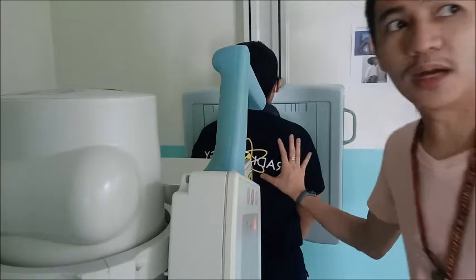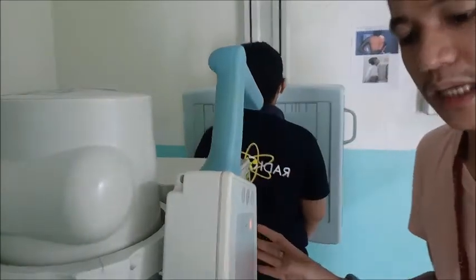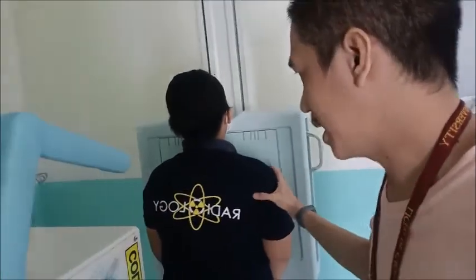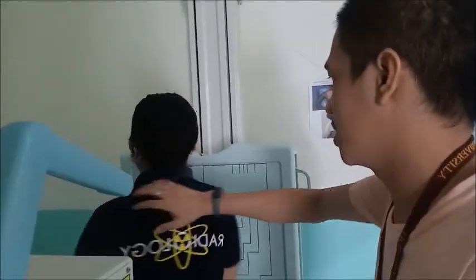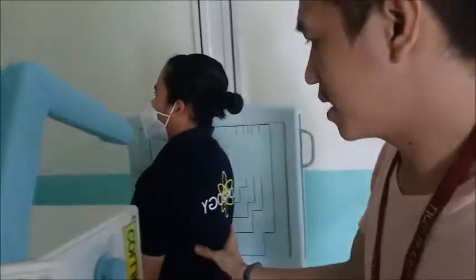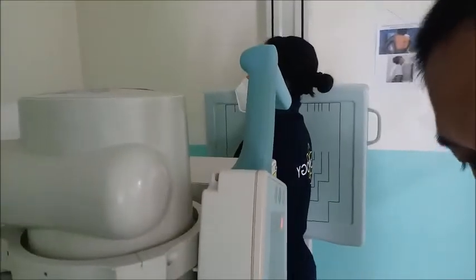So kanina, di ba, kung mag-chest PA tayo, wider ang anatomy, ang positioning niya. Ang tawag nito, ang orientation, di ba dalawa. Pero kung naka-lateral si patient, mag-superimpose na silang dalawa, so that means makita na siya, isa na lang sila. Magamay ang iyang body, iyang orientation.